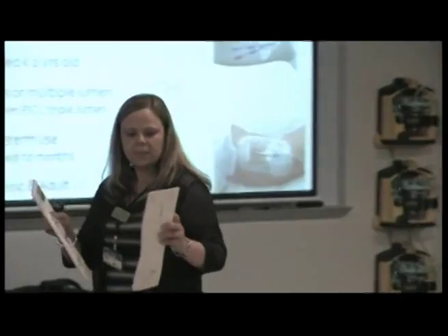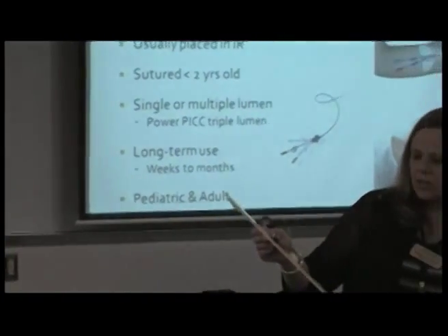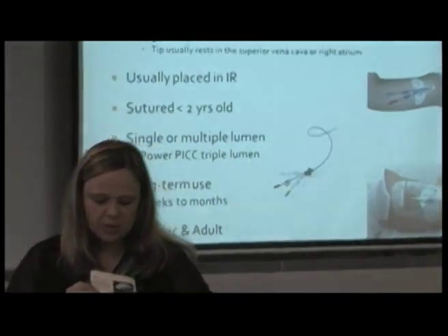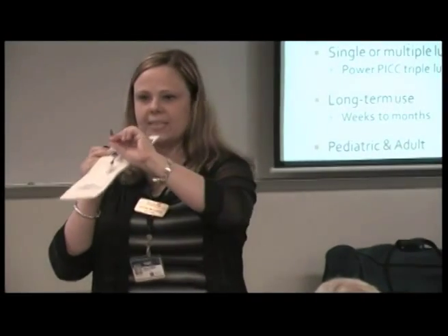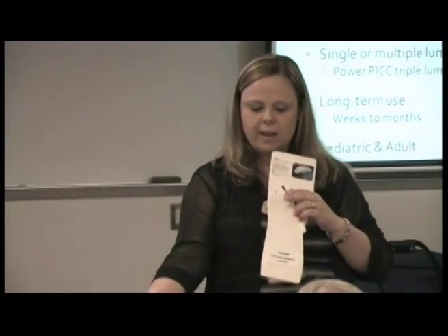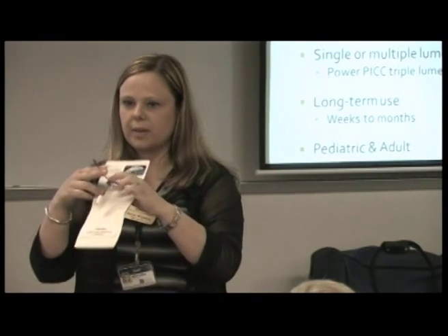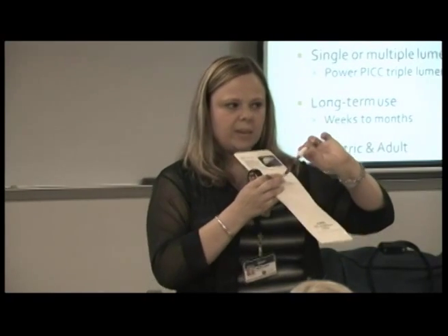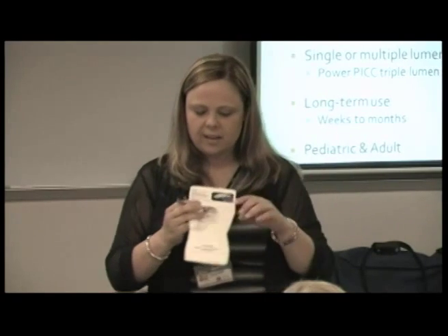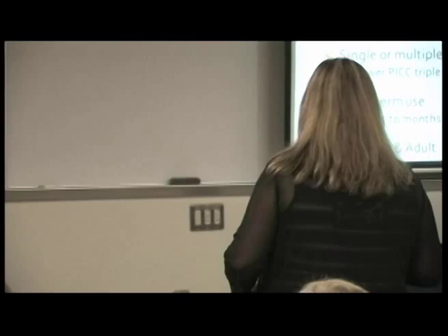These are both PICC line devices. They have different securement devices, but you can see how they come off. This one doesn't have a cap. We would not like to see this because if we unclamp it, it could potentially bleed out, and it's not a very good technique. We would be really worried about somebody having an infection. So they should always have some kind of caps at the end of them. But I'll pass this around so you guys can see the PICC lines.